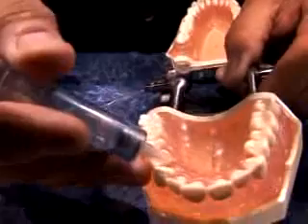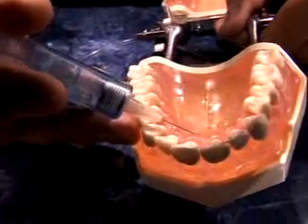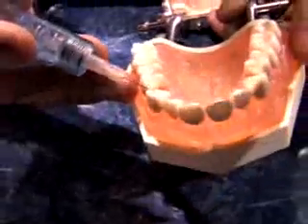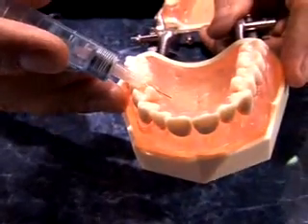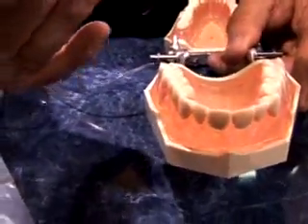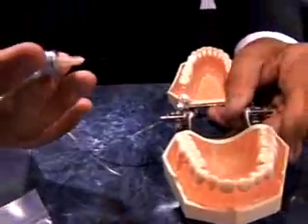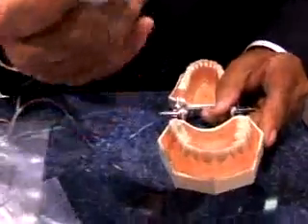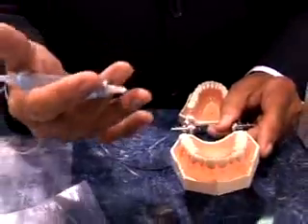There's another injection we give in this area, in the nasal palatine area, called the PASA, which will numb 6 anterior teeth and the related gingival and palatal tissue and the labial buccal tissue without, again, numbing the patient's lip and face. This is wonderful for cosmetic dentistry, aesthetic dentistry, where you need to assess the smile line because the patient's lip and face is completely normal.